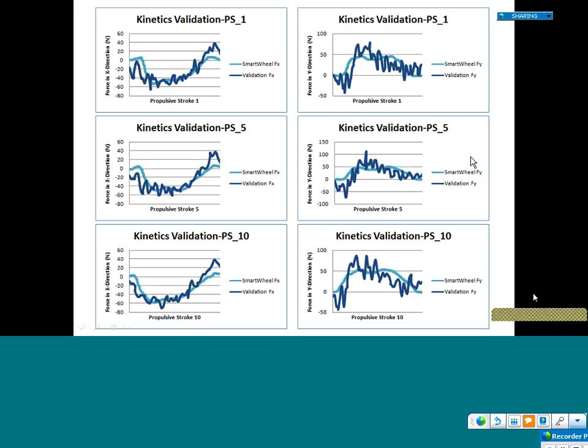What I'm also comparing is the smart wheel, the original f of y, with the new calculated contact force at the hand, the f of y, and when that shows similarity and the traces are the same, that's impressive, because the f of y that I just calculated in the model is completely independent of any of my inputs. Remember, I'm only using the f of x as an input into the wheel torque. So the fact that I am able to get out an f of y that matches my smart wheel is a real positive means of validation.